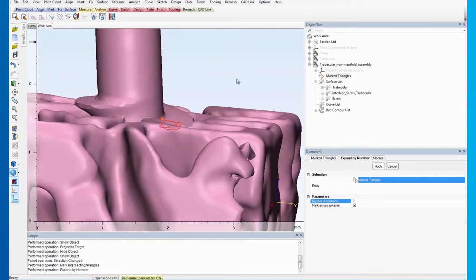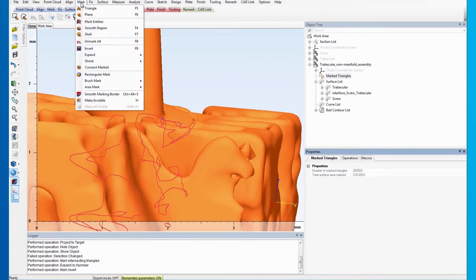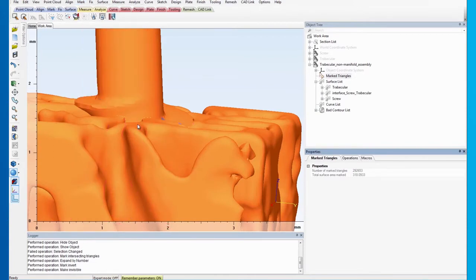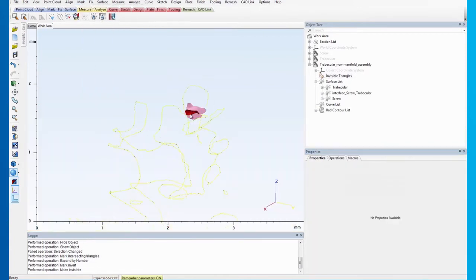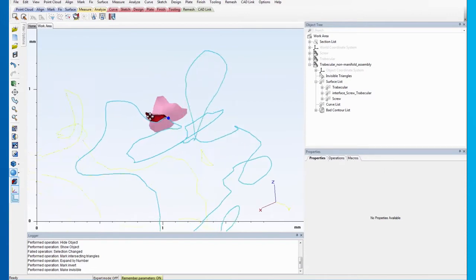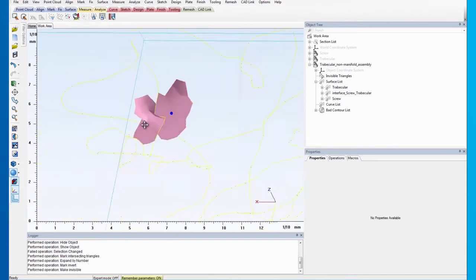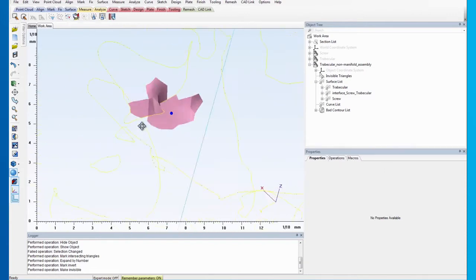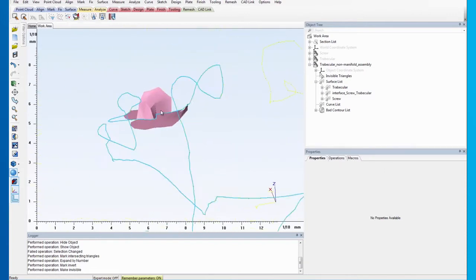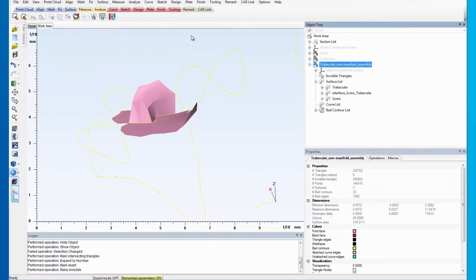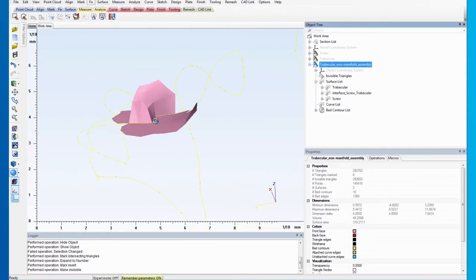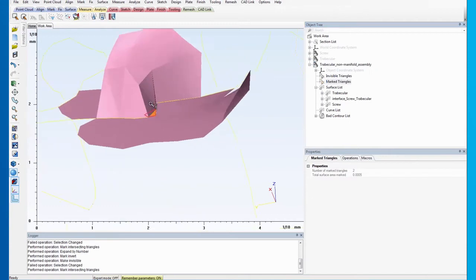Next, invert the marking and hide all the marked triangles to single out the island that contains the intersecting triangles. Mark Intersecting Triangles again to highlight them.